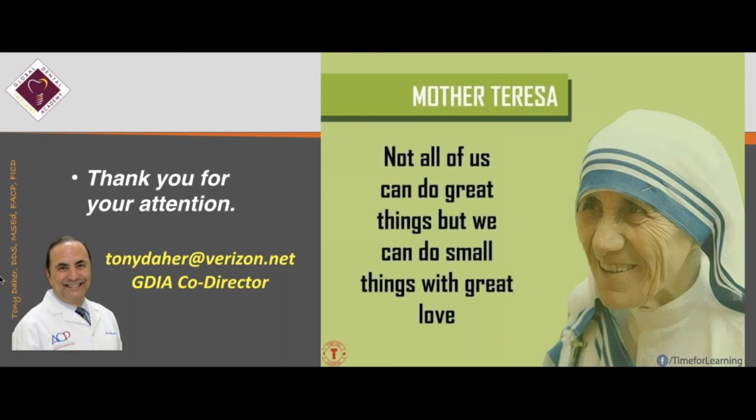They don't have a good muscle coordination, facial neuromuscular coordination. 1 implant can help because of their health, because of the money involved and so on. But certainly 1 implant is better than nothing. So 1 implant can be a good indication for these types of patients. V-shape, 3 implants. U-shape is very good if you have enough bone and you place more than 2. When to choose a ball attachment and when to do a bar attachment?